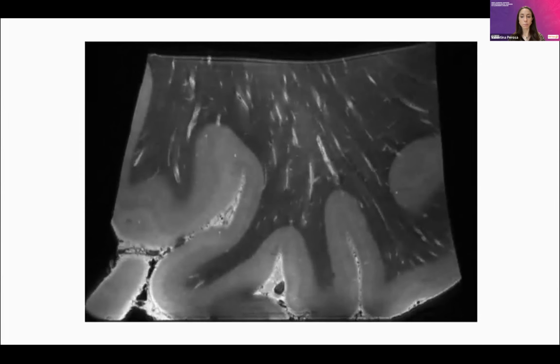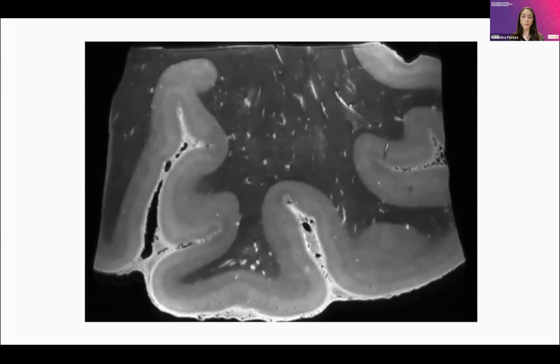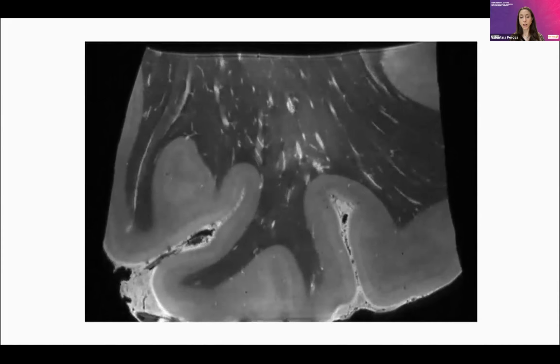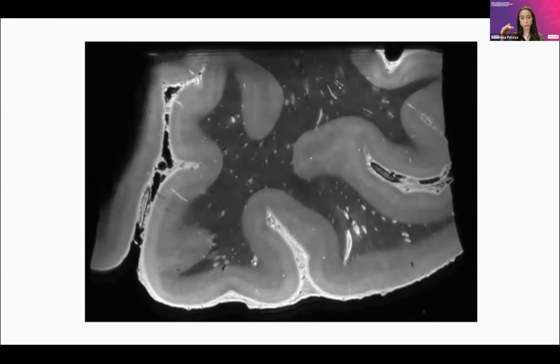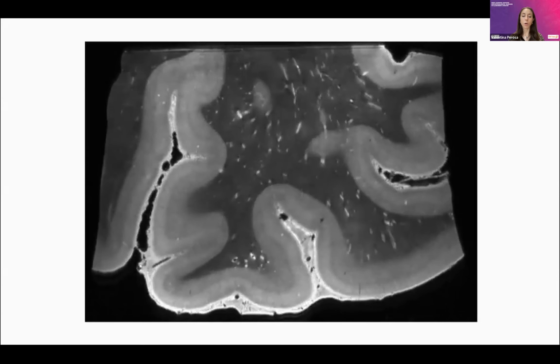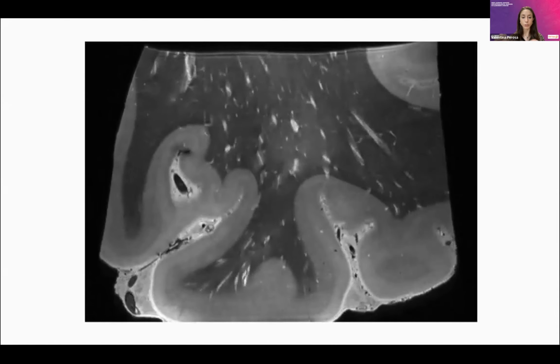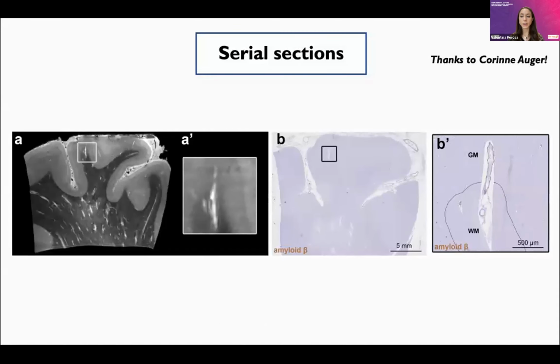The first observation that we can make in most cases is that the perforating arteries, as we suspected, the ones that dive into the cortex, also continue into the white matter, and that the enlarged perivascular spaces are around these vessels. The enlarged perivascular spaces also continue sometimes into the gray matter, as you can maybe observe. So what seems completely disconnected on 3 Tesla MRI obviously has a continuation between cortex and white matter at 7 Tesla MRI. After scanning, both blocks were then cut and placed into thin cassettes.